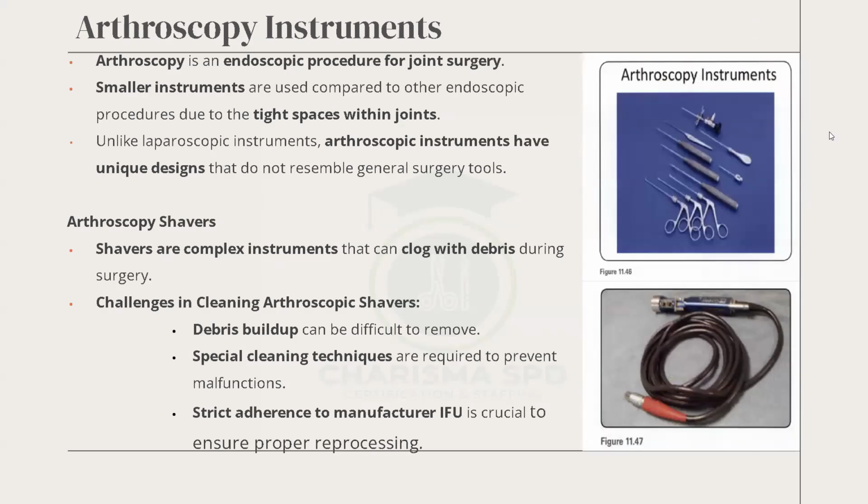All right. So now we come to arthroscopy ward instruments. So you see the picture at the top, 1146. They are the instruments. We have the scope. You see the scope at the top. The very top item is the scope. That is the rigid scope that they use to see. These instruments are small. Some of them are graspers. Some of them are trocars, or what have you.